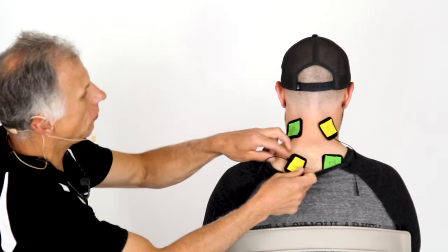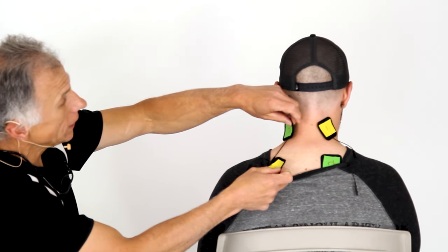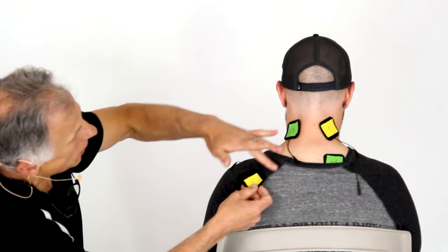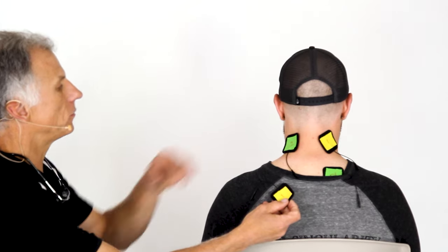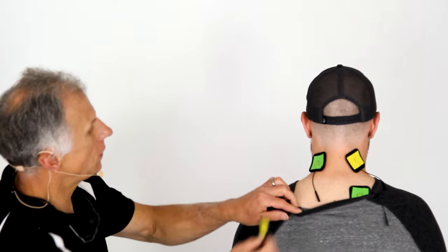That's really the only way you can do it because you don't want to go over the spine with either pad. You could spread it out a little bit more, but then the pads get too far apart. The neck is probably the area where you're most limited and have to remember these precautions so you don't have a problem.